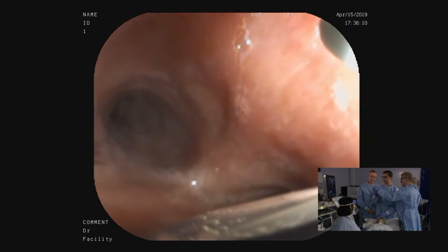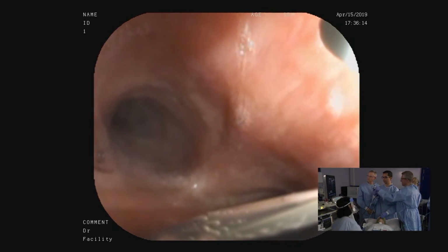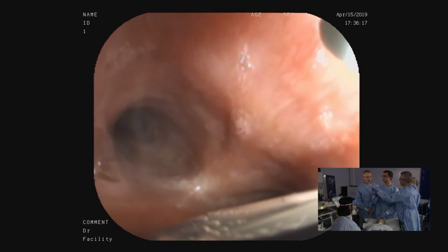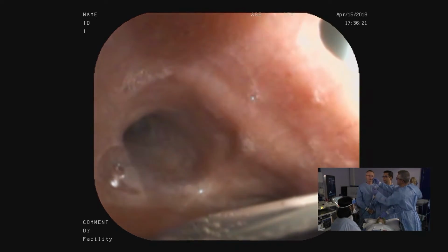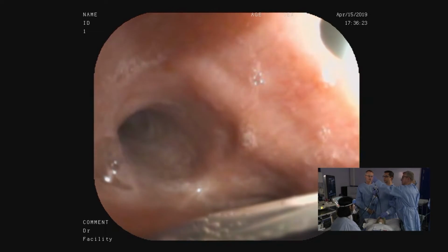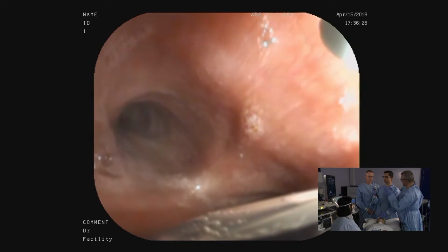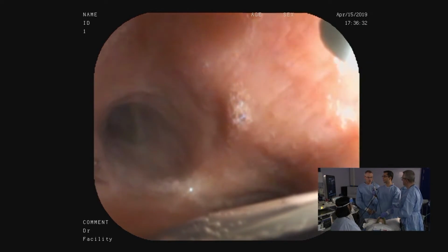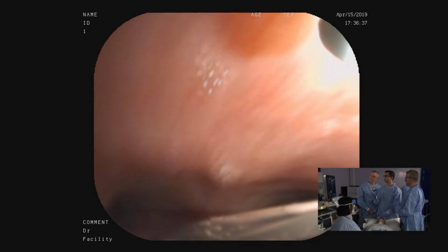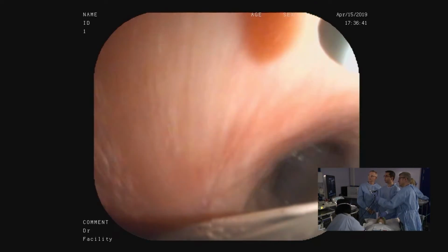Secondly, I've already visualized the node target, and it's at least 3 centimeters, so I'm setting the needle length to no more than 3 centimeters in the first instance. This is a standard rather than a ProCore needle, so we usually have about 1 centimeter of the stylet withdrawn, which exposes the sharp needle tip. And this is a 22 gauge FNA Cook needle. Sorry, I think this is slightly loose. Yeah, that's okay.